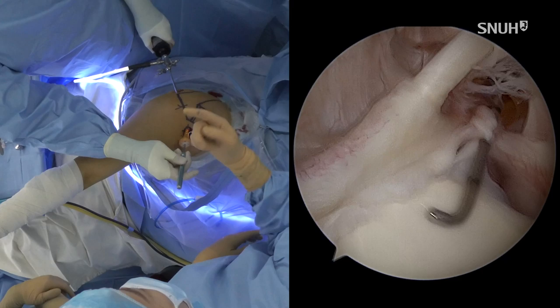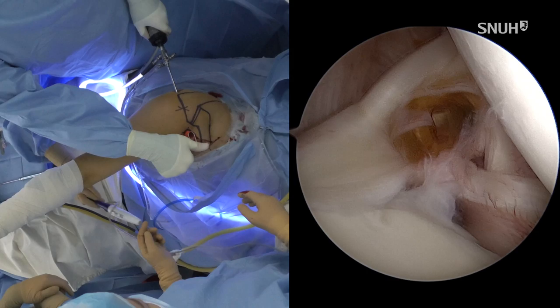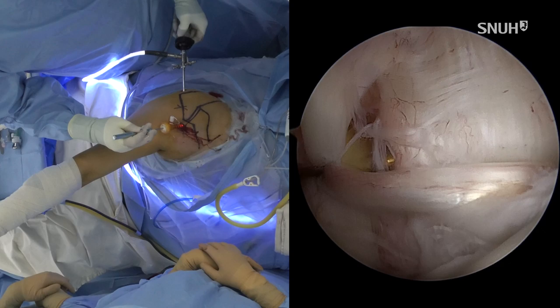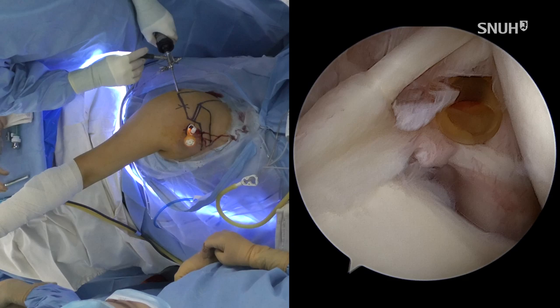For the supraspinatus, it's a partial articular-side partial tear, but that's not that significant. We also have to check the biceps tendon. We can pull the biceps tendon and look at it through the biceps groove. There is no synovitis and no partial tears around there, and the biceps sling looks intact, so the biceps is okay. So after decompression, instead of a biceps tenodesis, I will repair the SLAP.